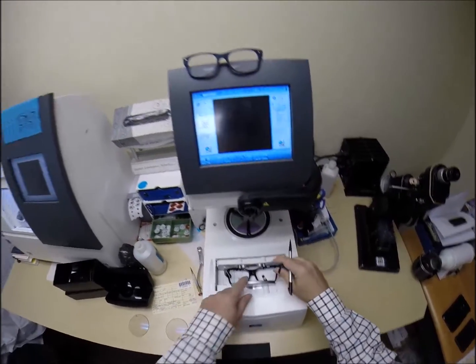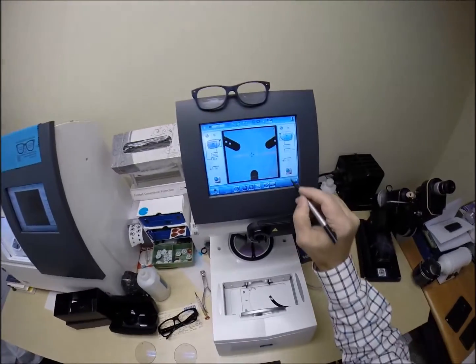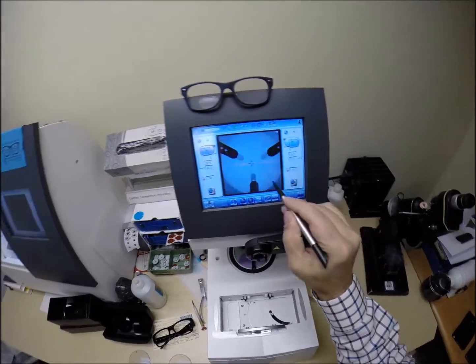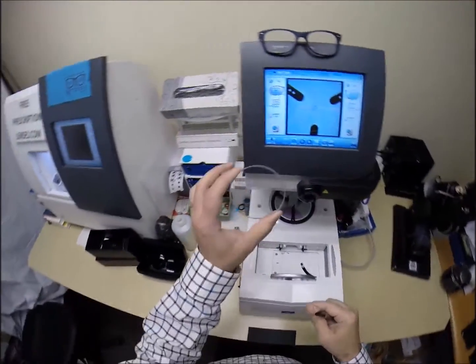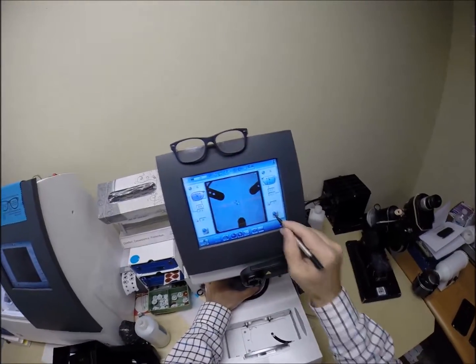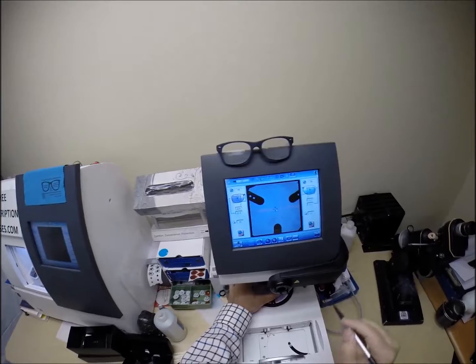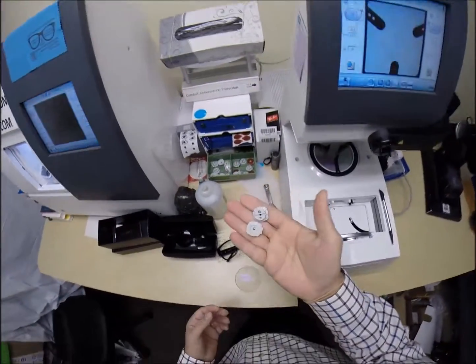Move on to the next screen here. I'll go ahead and take that out. That is no longer needed. That is the shape of the lens we will be cutting, only magnify that green outline. I'm going to magnify it while I work on it. Of course, I love how they put right and left on here, even though these are non-prescription. I want to check one thing, make sure the lens is large enough and it's centered. We're looking good. Now, this is a block, or as I like to call it, Jenny from the block.